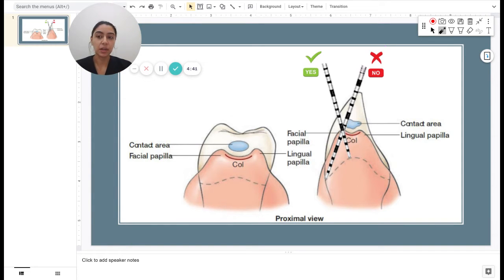In my previous video, I went over buccolingual surfaces and not really a 3D image of the proximal side. So in order to go in and see the CEJ, or the base of the pocket, I really want to go at an angulation, especially when it's a proximal surface. It's going to have another tooth beside it. So imagine there's two teeth right next to each other and I'm probing right here. So when I measure, I want to be at an angulation.